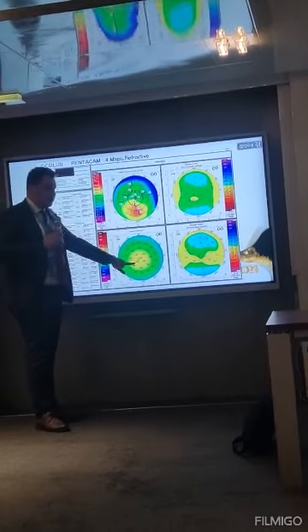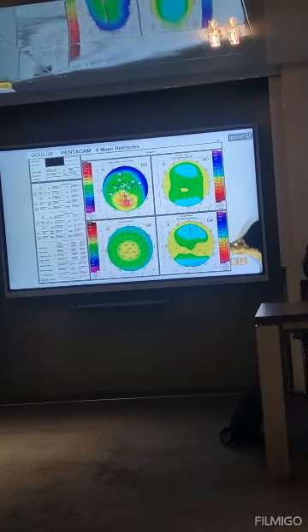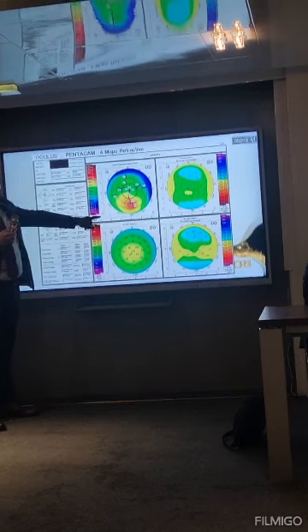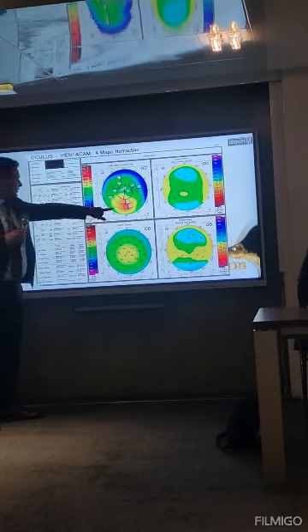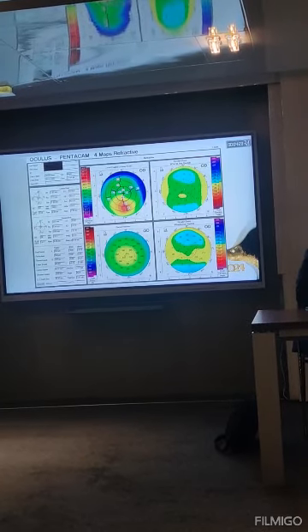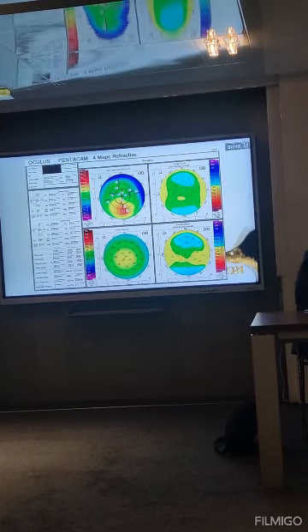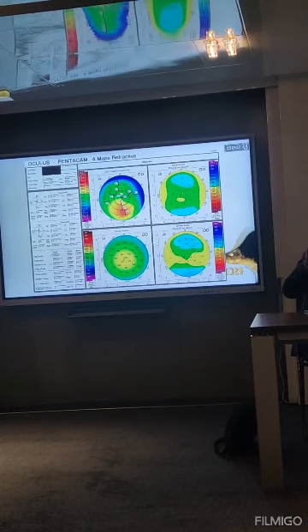Do you see anything abnormal in the pachymetry map? No. Okay. The only thing we should mention here is that this scale is a little bit noisy. It's 0.25, a quarter of a diopter, and it's intentionally noisy to clarify this area of inferior steepening. This case went to a lot of refractive surgeons, asking them to do LASIK. And would you do LASIK for her or PRK, Dr. Mazen? I have to see other profiles.